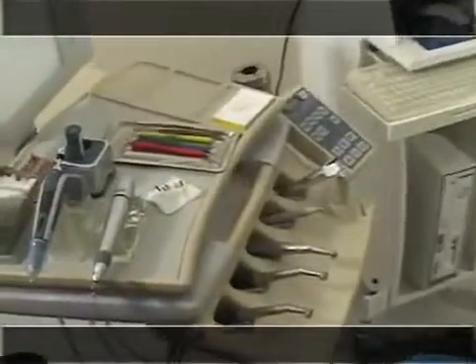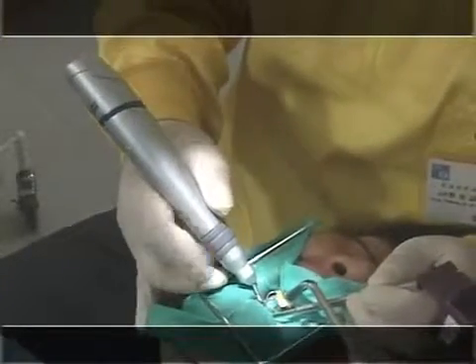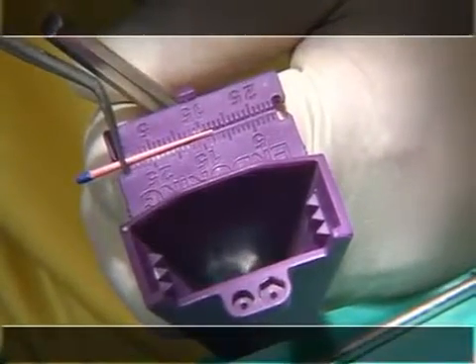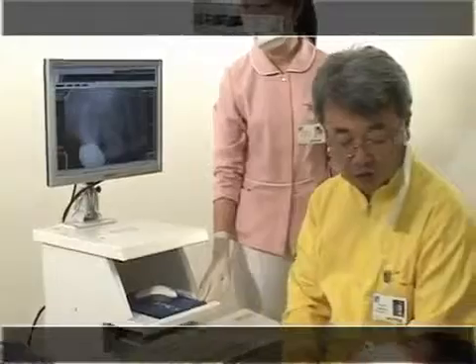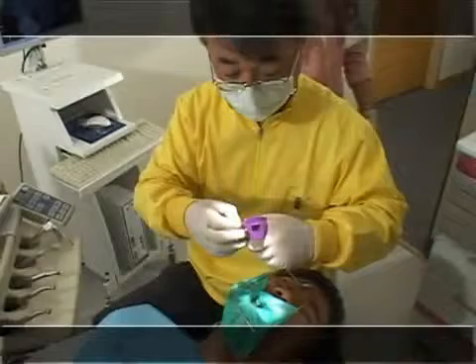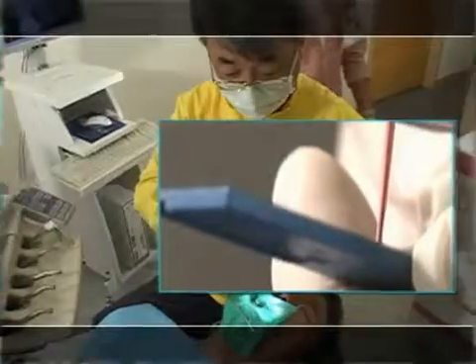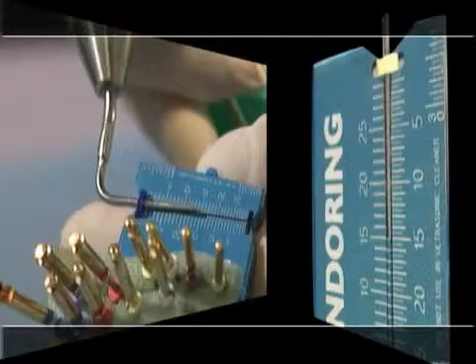We will now show a direct performance using E&Q Master. First, this is down-pack vertical press technique using the pen. Select a Gutta-Percha which is the same size as the file used for the last formation of the root canal. This case is about a patient who visited for root canal treatment for an upper first molar. Root canal formation was finished with a 0.04 taper number 60 file; disto-buccal and mesio-buccal canals were finished with a 0.04 taper number 40 file. Use a 0.04 taper number 60 Master Gutta-Percha point. Prepare two to three hand pluggers to condense Gutta-Percha and mark the root canal length with a rubber stopper.